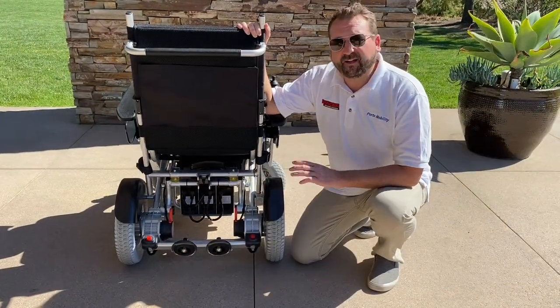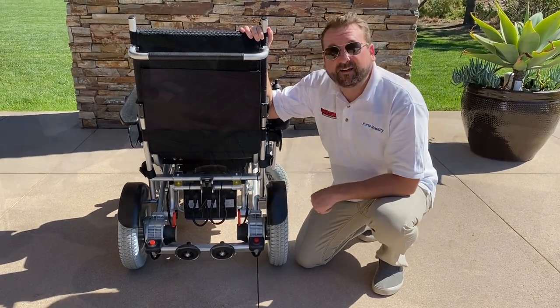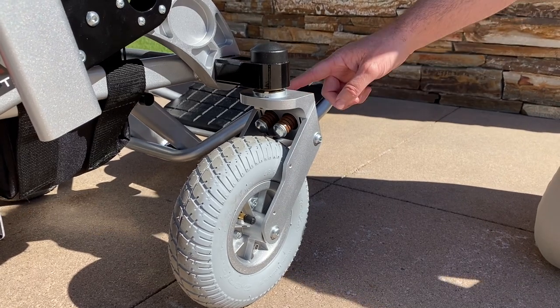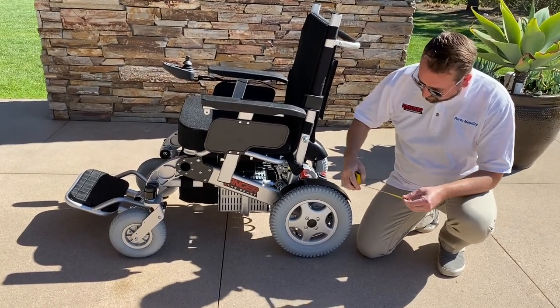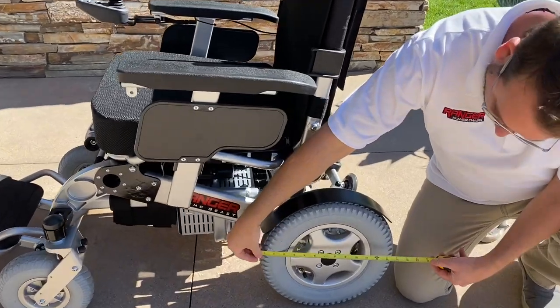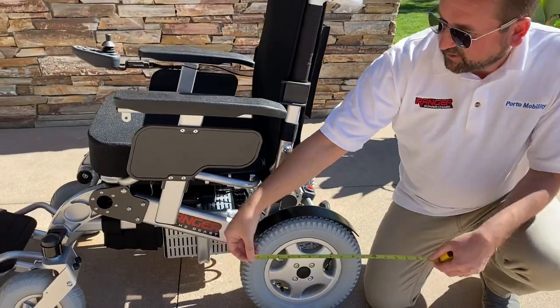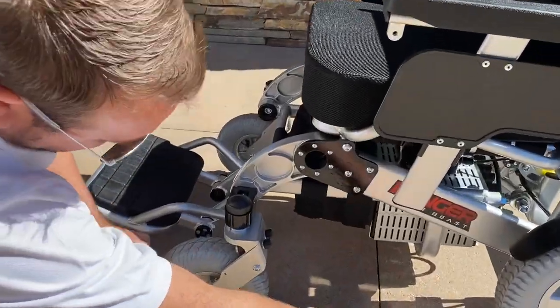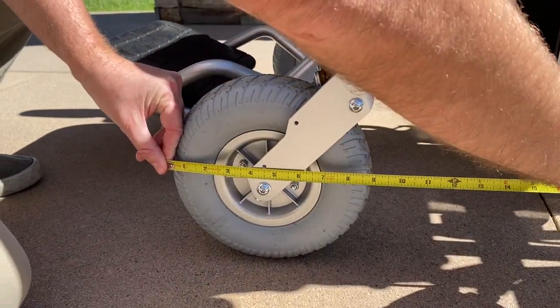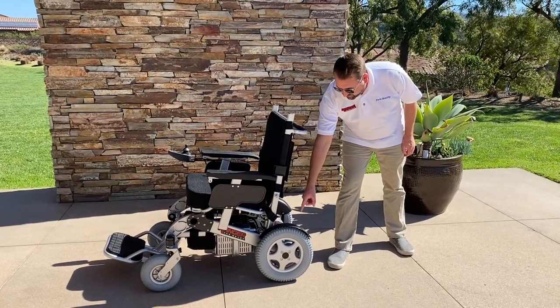What makes the Beast different from any other Ranger series chair is that it's got six shock absorbers — two in the back and four in the front, two on each wheel. The Beast has four air-filled tires which are as sturdy as motorcycle tires. The rear tires are 13 and a half inches — the biggest in the series. The front tires are nine inches. This model also comes with a fender on the rear tire for extra protection.